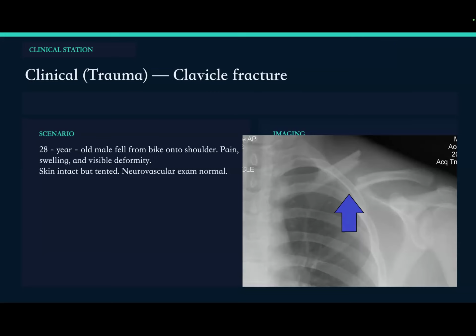Yeah, so this is an AP radiograph of the left clavicle. This is not the shoulder. This is inadequate, showing an oblique fracture of the middle third of the clavicle with superior displacement of the medial fragment. I cannot see any dislocation in the glenohumeral or the AC joint, and I cannot see any obvious rib fractures. Ideally, I would need orthogonal views, and a better view of the chest to rule out pneumo or hemothorax. And then carry on with what you did.